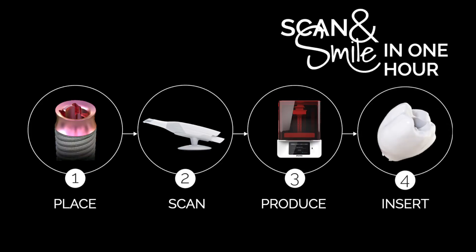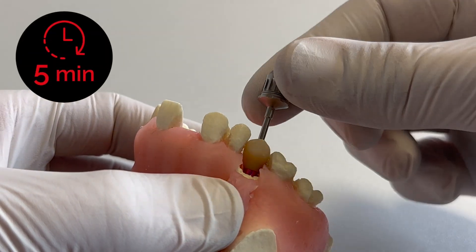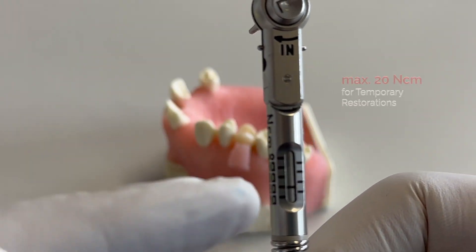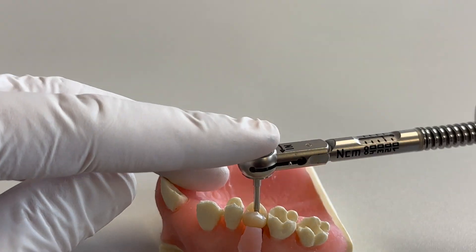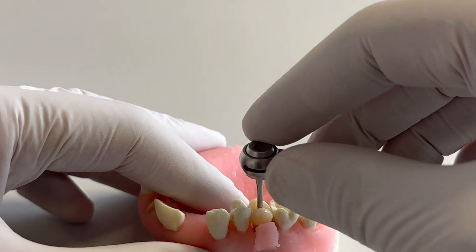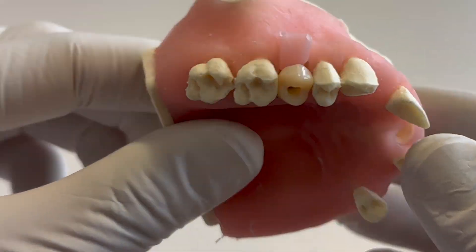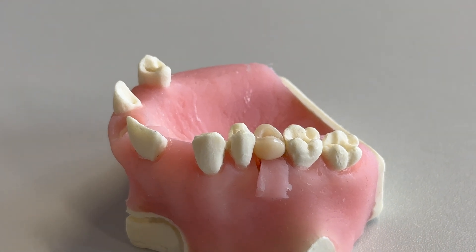Moving on to our last step, insertion. Insert the prosthetic screw into the crown by using the matrix screwdriver. The screw will centralize the prosthetic into the right position. Use the torque control and screw retain the prosthetic into the patient's mouth with a maximum of 20 newton centimeter. Seal the screw channel with composite within your standard procedure. John looks great and can leave the practice after one hour with a fresh smile and a crown that costs less than one dollar to produce.